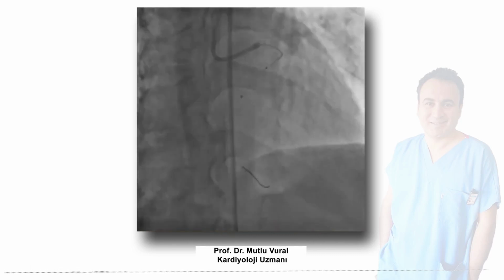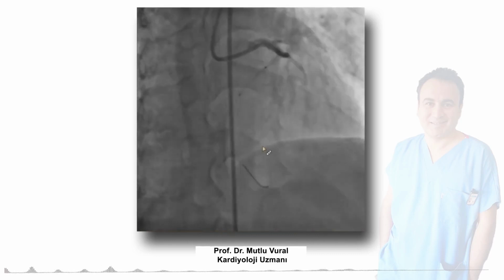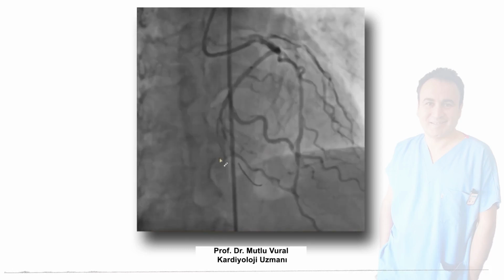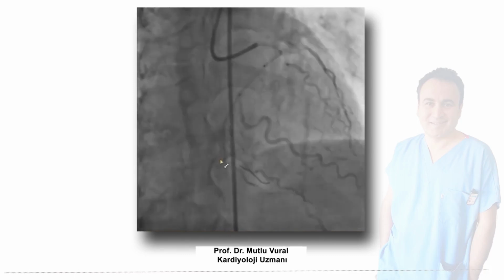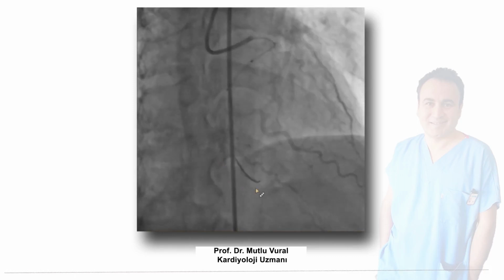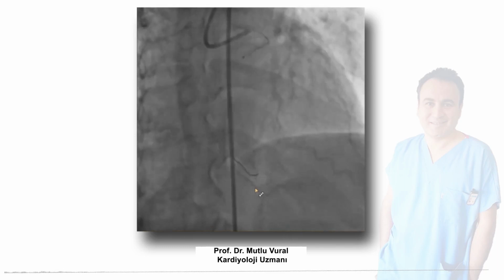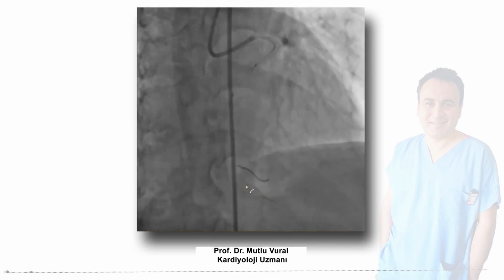The distal 2/3 is not dilated. And then we deflated the balloon and checked the angio. And we realized that the wire was in a tiny branch. If we dilate it at high pressure, it would result in coronary rupture. We should be very careful if we are not sure about the position of the wire.